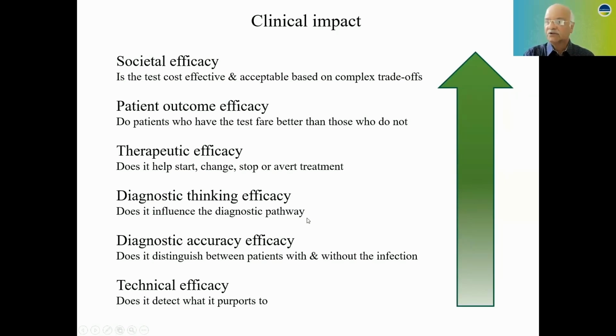And certainly it does. So when you have a test which is negative, the clinician must now start thinking about what are off-panel organisms. And Dr. Septimus again told us about Stenotrophomonas, and certain other bacteria. But depending on our local epidemiology, it could be TB, it could be, if it's immunocompromised, it could be Nocardia, it could be an invasive mold infection, and so many other things which are not represented. Melioidosis is also something which we think of in our country, in some parts of our country.